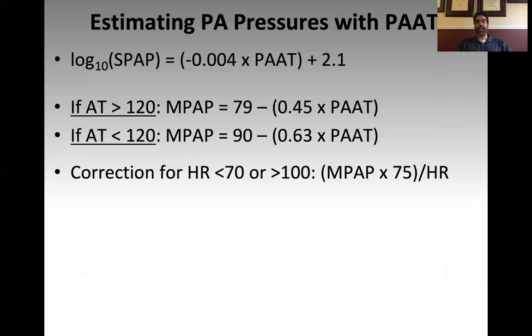Okay. Now, what do you do with that information? So there are two sets of equations out there that correlate acceleration time with PA pressures. The first correlates it with systolic PA pressure, but when I look at this, I see this log thing, and that scares me, and that scared most clinicians. So really, this equation isn't used all that much. It's not all that well validated. The equations that we use are actually these, the ones that correlate acceleration time with mean PA pressure, okay?